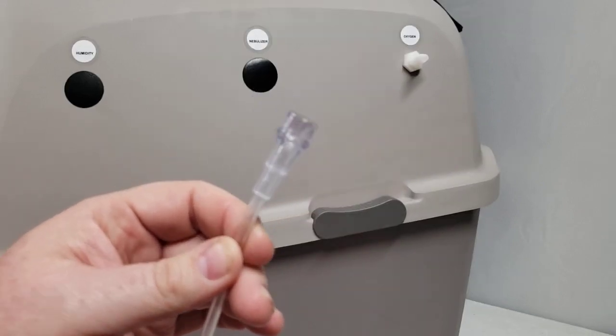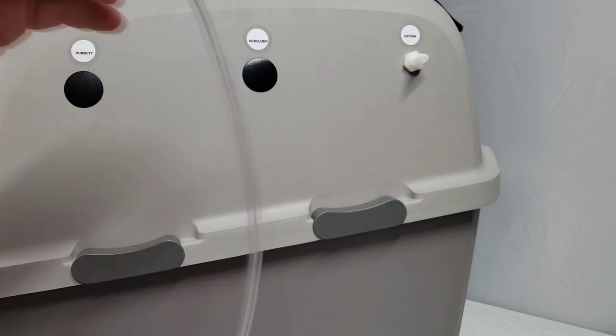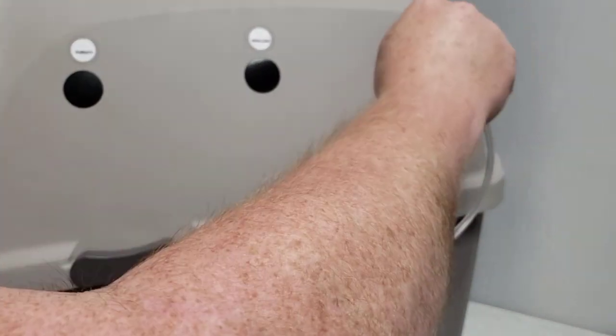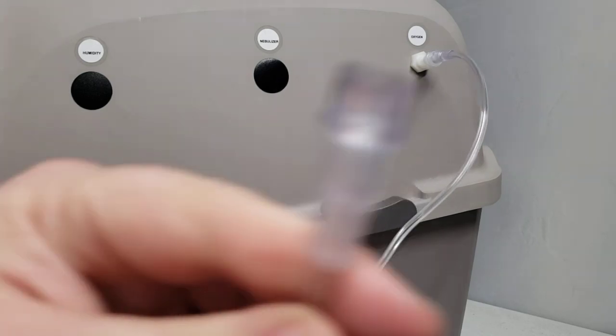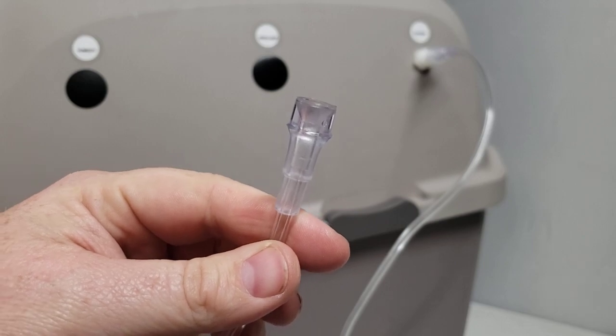One of the ends looks like that. The other end is pretty much identical, looks exactly the same. You're going to go ahead and take one of those ends. I usually hold it from the inside and just push that down until it feels snug there. The other end of your tubing is going to go to your oxygen concentrator, and we'll take a look at that now.